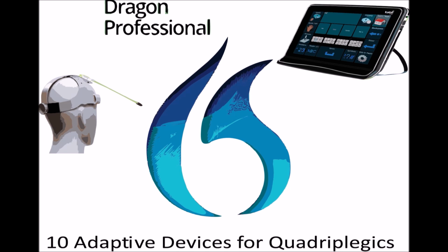ECUs are especially useful for individuals with limited mobility or disabilities that affect their ability to perform everyday tasks. They can help these individuals to control their environment independently, without relying on the assistance of others. ECUs are available in a range of sizes and configurations, from small portable units to larger wall-mounted systems. They can be installed in homes, hospitals, and other settings to provide greater independence and accessibility for individuals with disabilities.